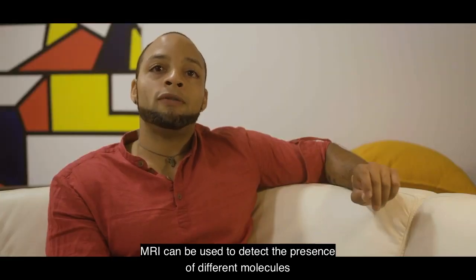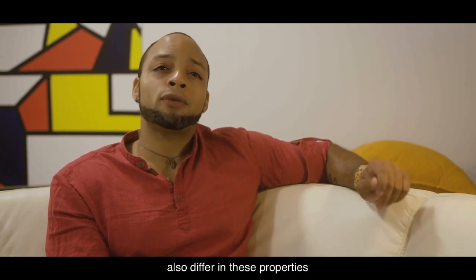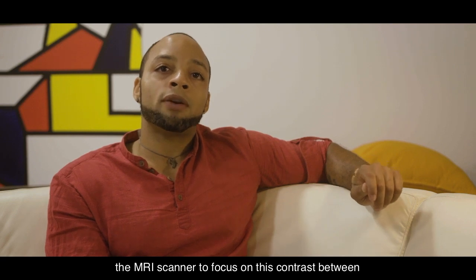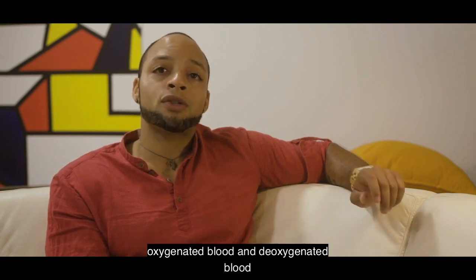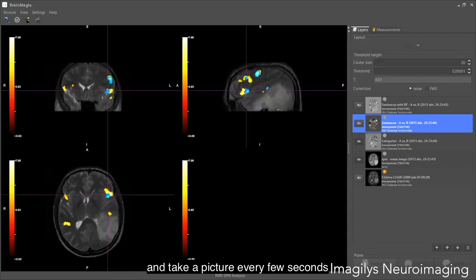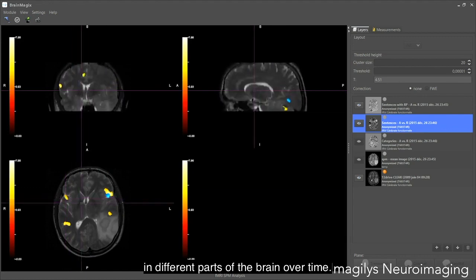fMRI. MRI can be used to detect the presence of different molecules like water and fat because their magnetic properties differ. Turns out oxygenated blood and deoxygenated blood also differ in these properties. Therefore, if we can set up the MRI scanner to focus on this contrast between oxygenated blood and deoxygenated blood and take a picture every few seconds, we can create a movie of how oxygen is used in different parts of the brain over time.